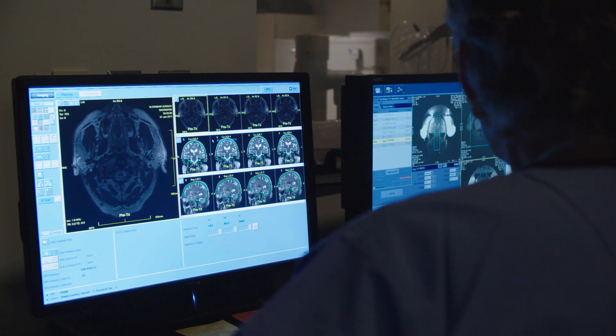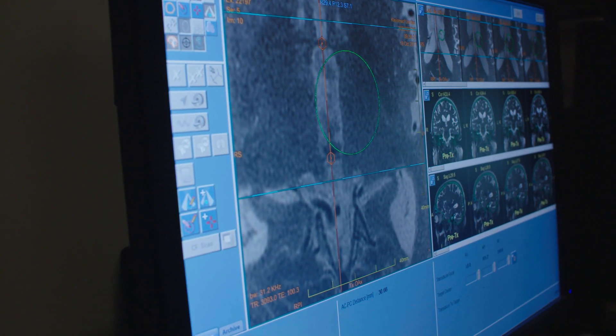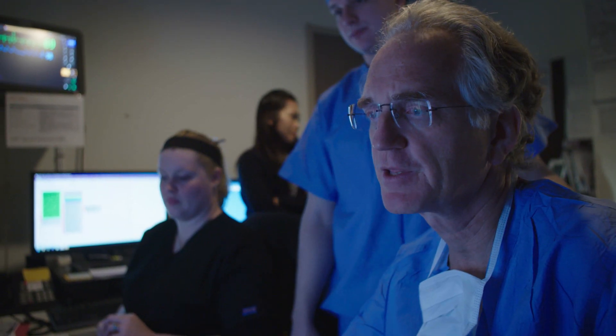We're looking at the anterior commissure, posterior commissure, and the thalamus, setting up the targeting for this procedure. We're going to center where the target is going to be with the center of the globe.